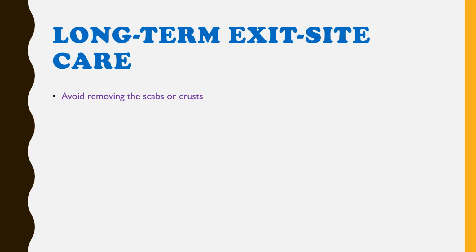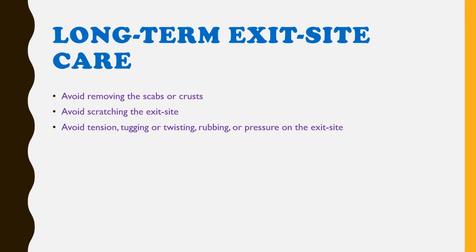Avoid removing the scabs or crusts. Avoid scratching the exit site. Avoid tension, tugging, or twisting, rubbing, or pressure on the exit site. Avoid agents that cause irritation to the skin.